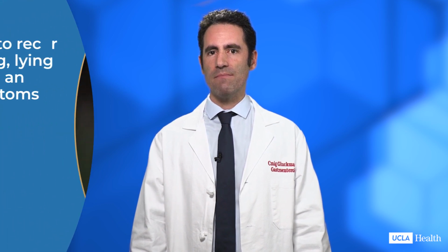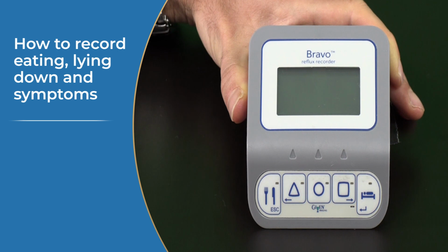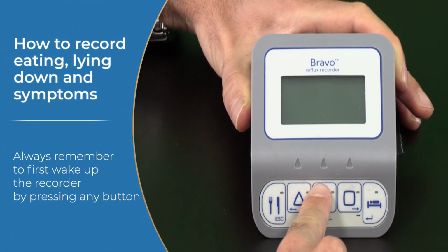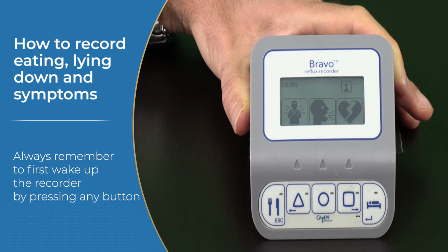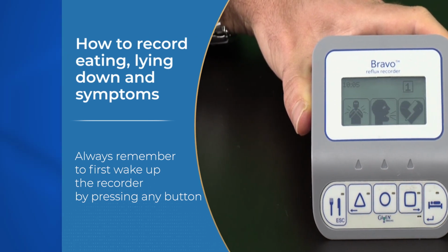You will also use the Bravo recorder to mark when you have a symptom. The triangle, circle, and square buttons are assigned to your symptoms. The nurse will assist you in assigning your symptoms to these buttons. If the display is dark, wake up the recorder by pressing any button. Symptoms only require a single push to record them. Press the button once at the exact time you experience the symptom.